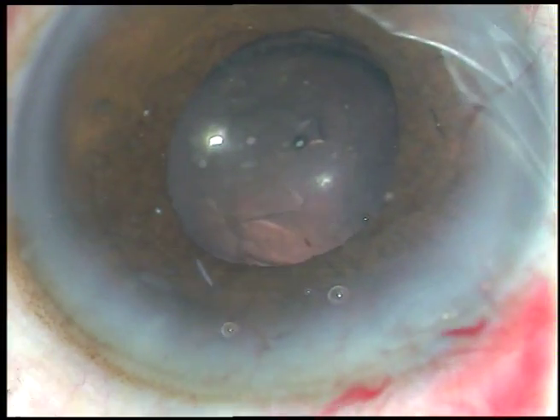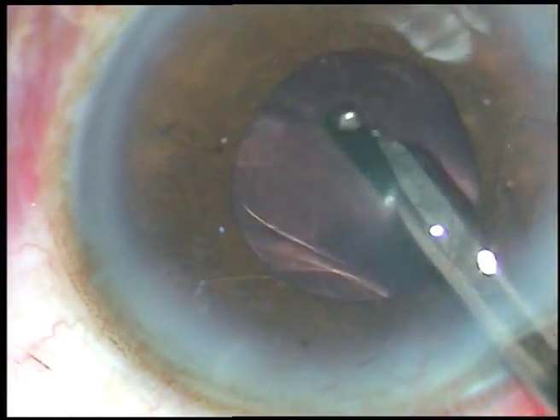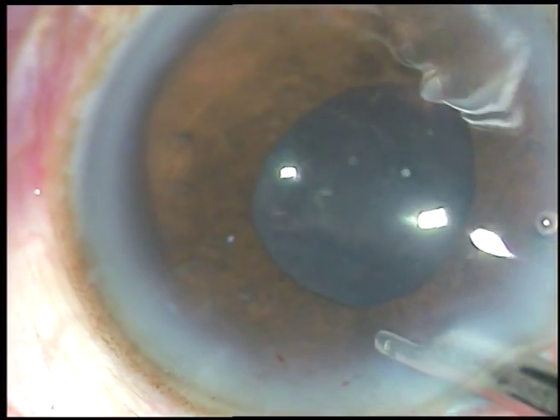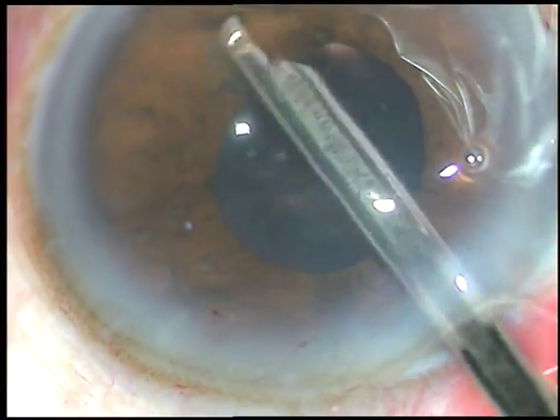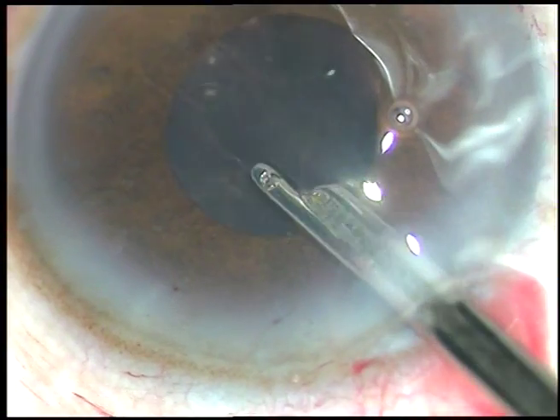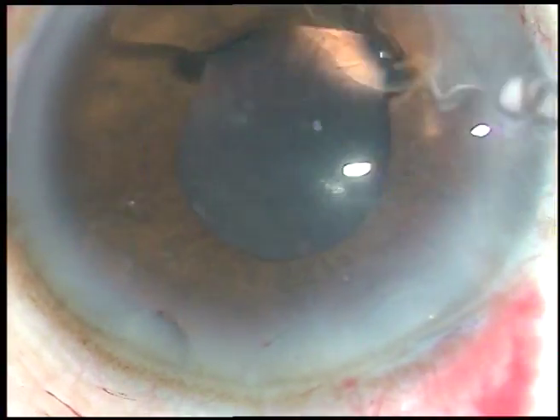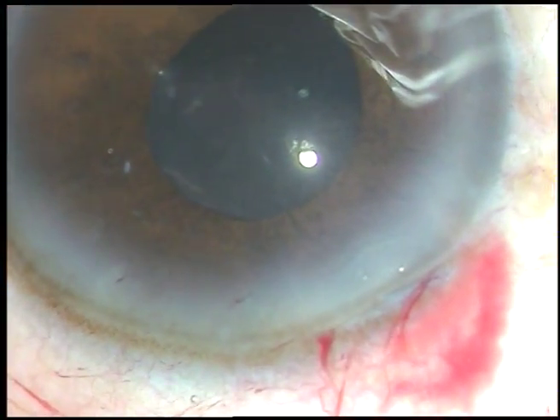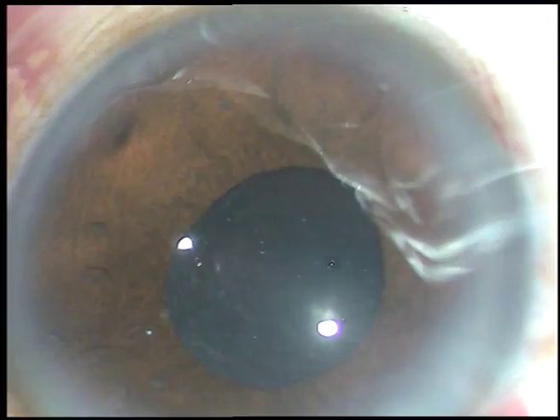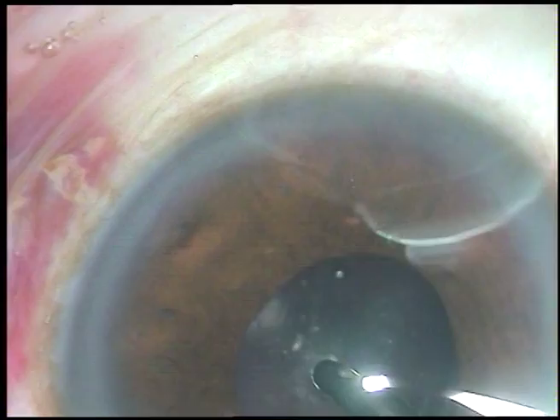Now I am going to remove residual cortical lens matter and viscoelastic substance with the Simcoe cannula. It is very important to remove the viscoelastic substance thoroughly — whether you have used Viscoat, sodium hyaluronate, or any other agent — so that there is no rise of intraocular pressure in the postoperative period.